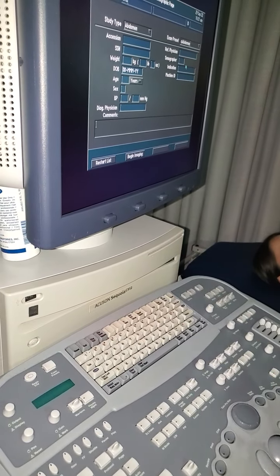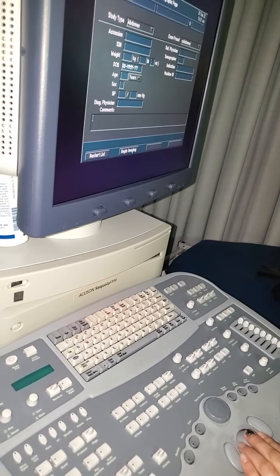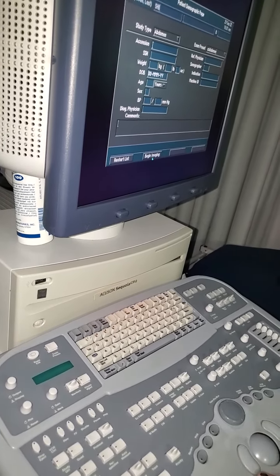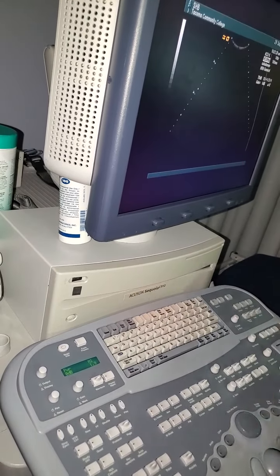So there's two ways you can do this. I have this little set button, or whatever you want to call it, this little mousey. I like these machines because I can touch them. Not all machines are like this. So you can either use your mouse, and these are my set buttons down here. Both of them will do the same thing, but I like to touch the button.